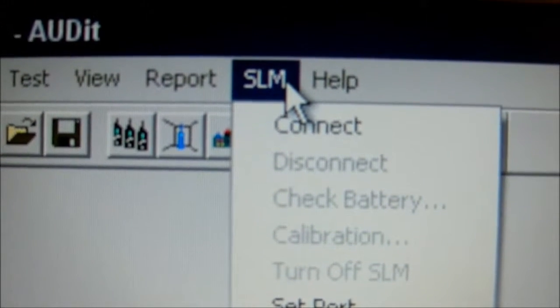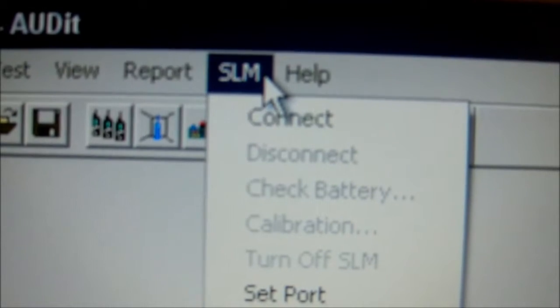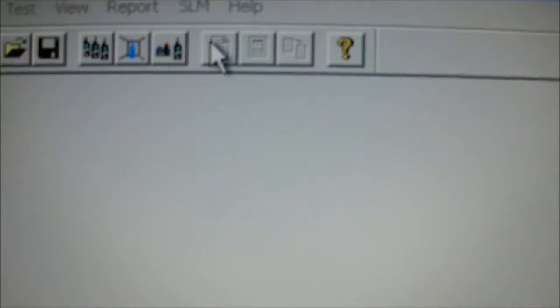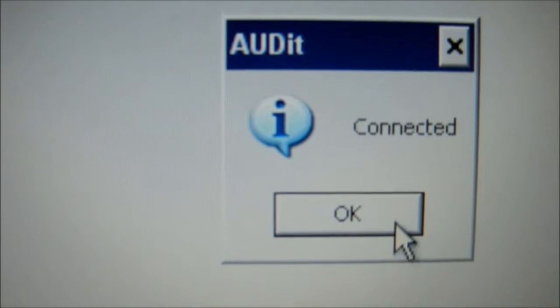Test of the building. We will select connect. We are now connecting to the sound level meter right now. It says connected. Click OK.